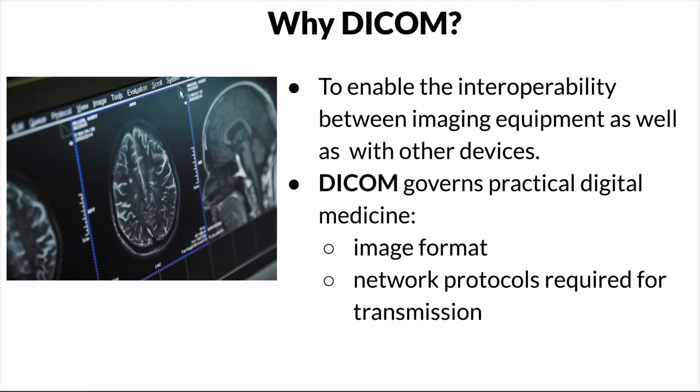So it governs practical digital medicine, such as the image formats, so that when you take a scan on one modality and you send it to another, you shouldn't struggle. You can convert it easily. Conversion should be quite easy, right? Yes, the image format. Then the network protocol required for transmission.